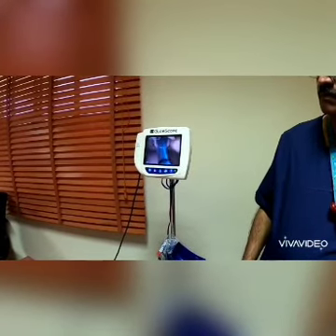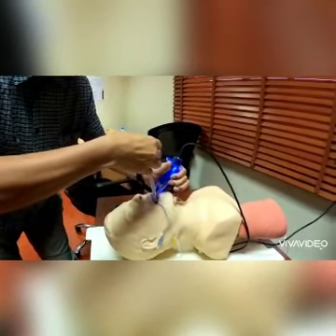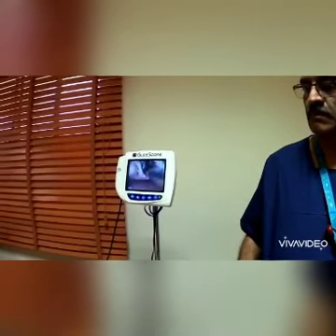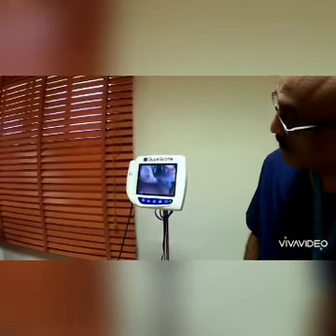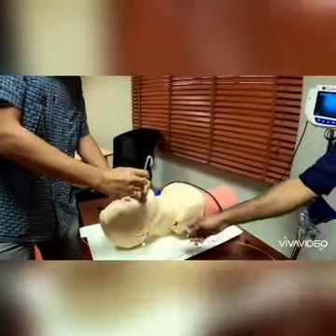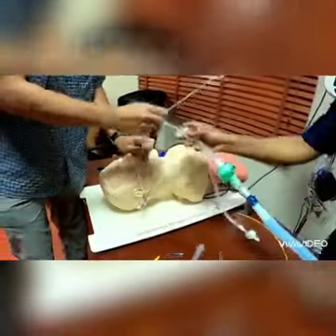So at some point, because it's at 90 degrees, I can't push it forward. I will need to pull my stylet out, and at the same time, I'm pushing the ET tube in. And with the same technique, I will stop at the vocal cord between the first and the second black line. Once I see that, I remove my glidoscope out, inflate the cuff, and remove the stylet and attach straight onto the ventilator.